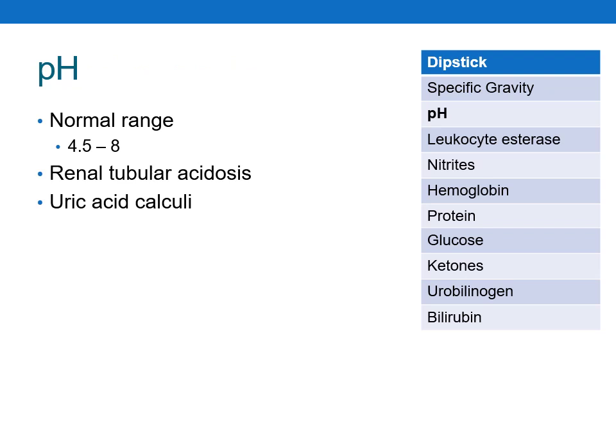A normal urine pH can range anywhere from 4.5 to 8. However, a vast majority of patients will sit with a urine pH between 5.5 and 6.5, on the more acidic range of the pH scale. Typically, urine pH can be used as a representation of serum pH.